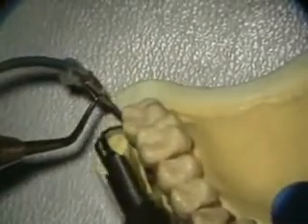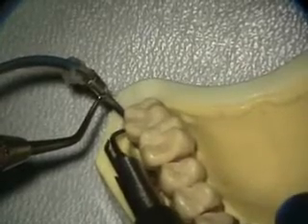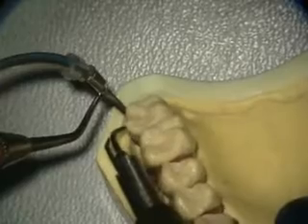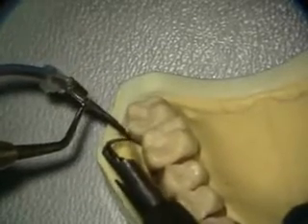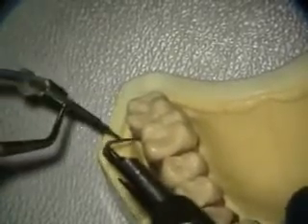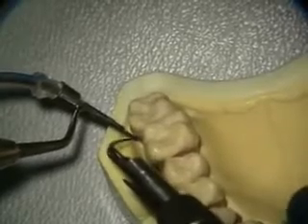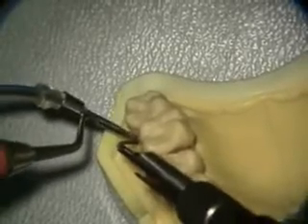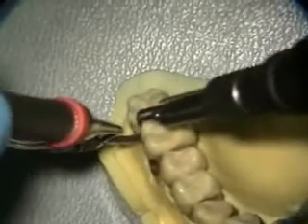This is probably the easiest place for me to just look up and I'm seeing everything all in the frame, and then I start cleaning at the distal, watching the screen, moving to the mesio. If something slips out, you have to look back in the mouth and reposition things. Sometimes actually you don't. You just feel your way back into the mesio here, angle it in.